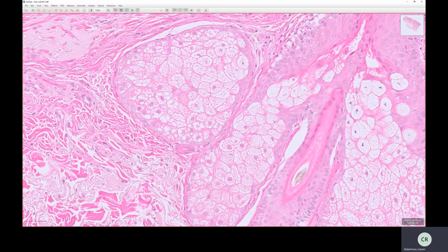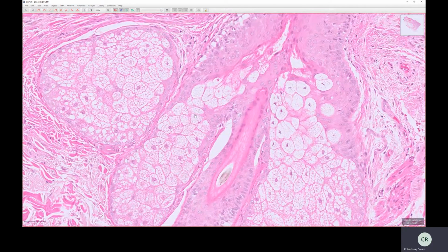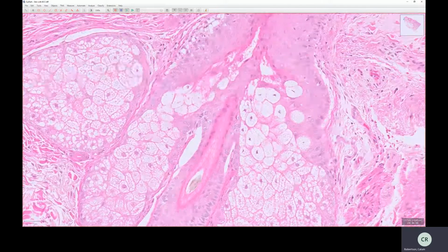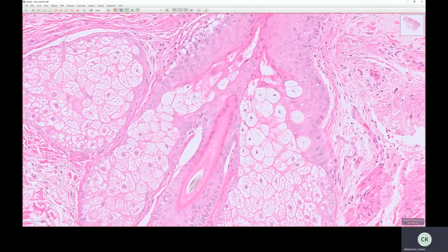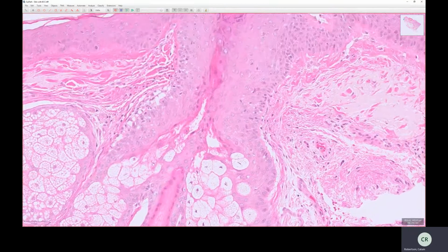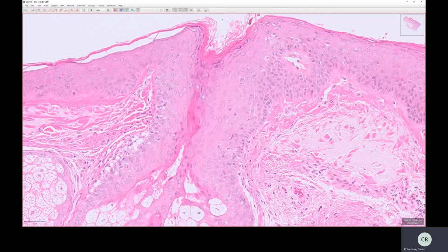Then they mature up, a bit like in the skin, in the epidermis, they mature up, and they die off under programmed cell death, apoptosis. You can almost see this in action here because you've got viable cells with viable nuclei down here maturing up, and then here you kind of lost the nuclei, and that's as these cells are dying off, and then as they die, they rupture, and the cells release their lipid, their secretions, up here into the hair follicle, I'm sorry, lumen, and then you can see how that secretion would continue up here onto the skin surface.